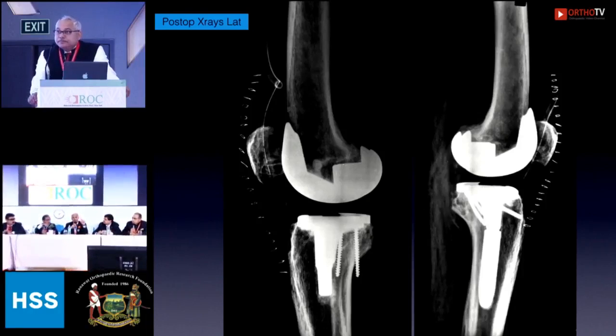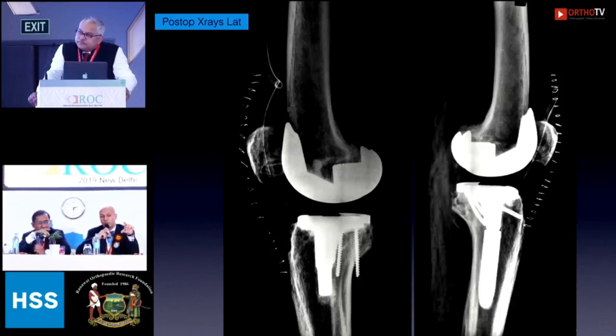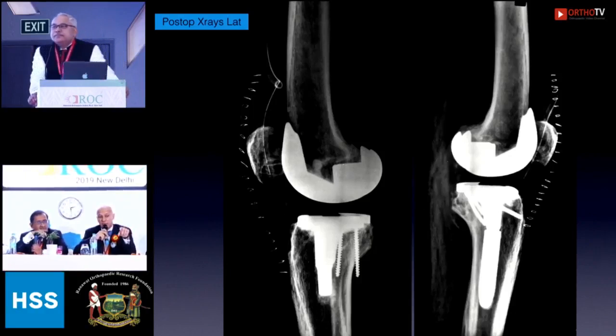I will take issue with the fact that this particular primary stem on the tibia is longer than most. Because of the length of this particular primary stem, I'm not sure that an actual stem would be as necessary. If you look carefully, the right stem is well and fully cemented, whereas on the left side, even though there's a stem, there's less cement.